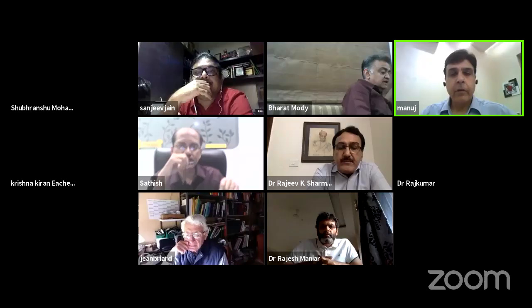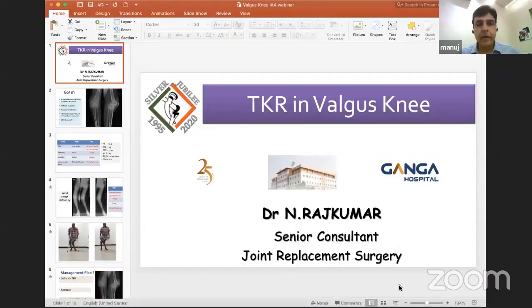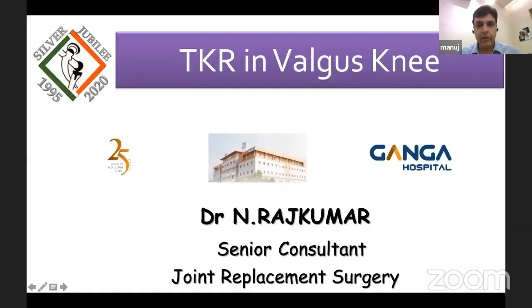So, Ronan, whenever you use a Ranawat block, and in order to balance your valgus knee, you have to put your block in external rotation. What has been your experience and your message to the audience? Because there are issues where you get anterior femoral notching by doing that external rotation, and also there is a maltracking of the patellofemoral axis. What is the way you get across these problems?